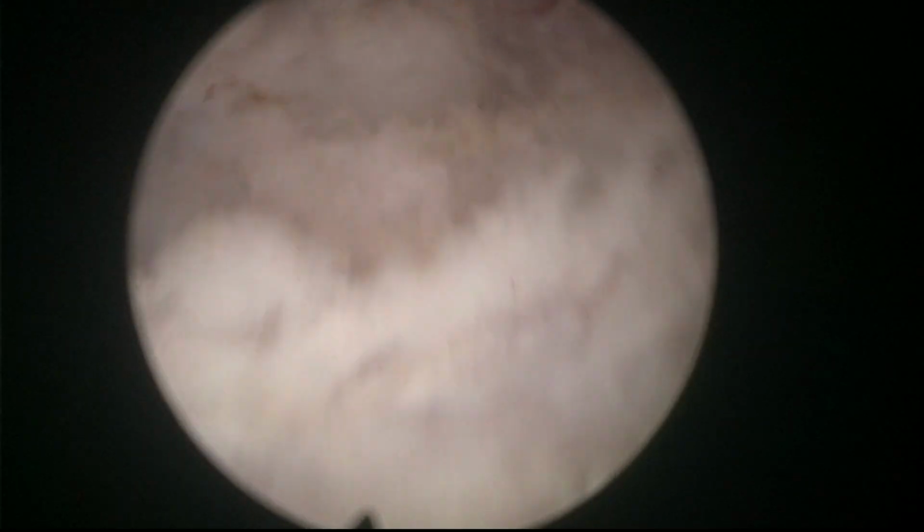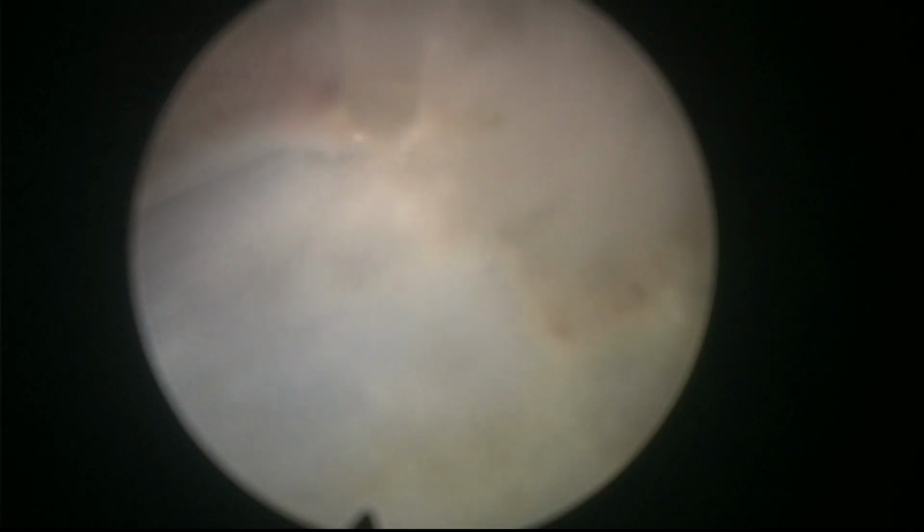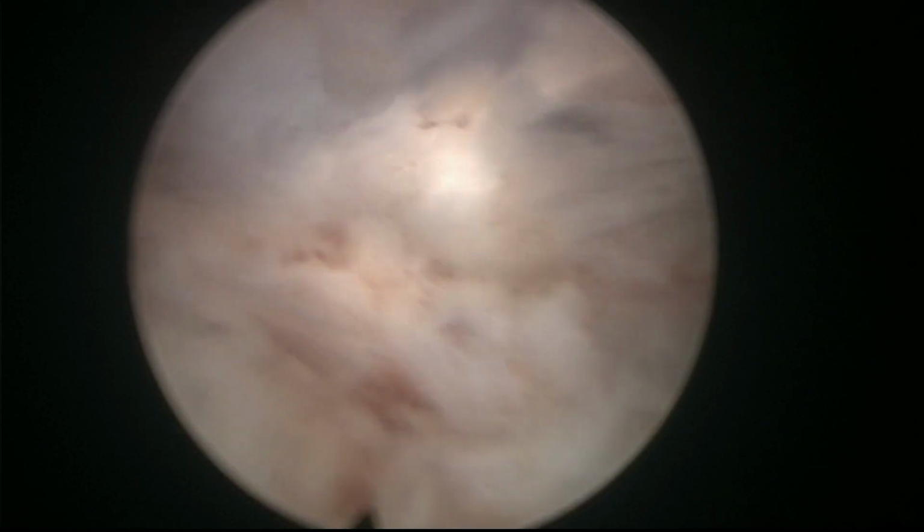Look at the volume of this adenoma. It's quite big and round, but we are progressing really nicely and efficiently, I would say. Nice visibility. It's like yellow tissue there. If it's too small, you can vaporize it like this. If it's bigger, maybe you can try to correct your plane and take it under that adenomatous tissue, but sometimes you have to judge. You don't want to go too deep.